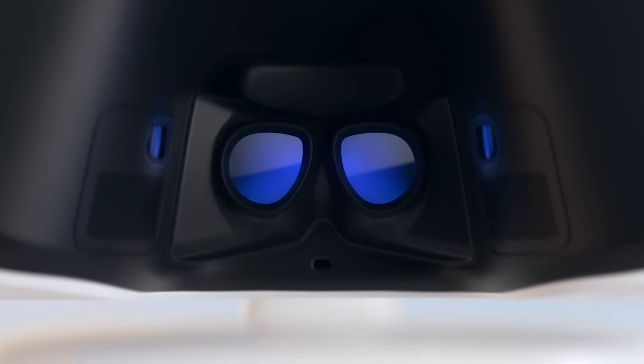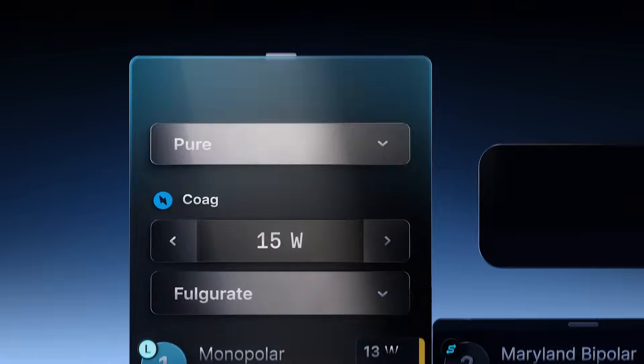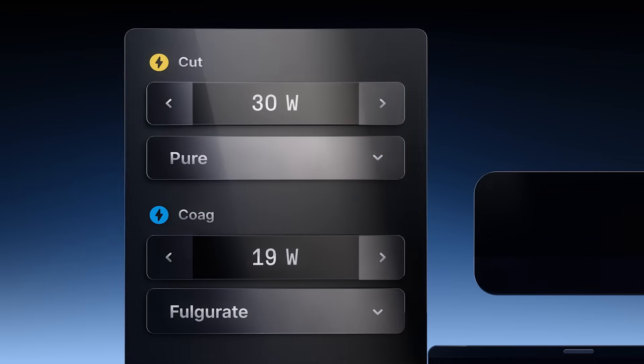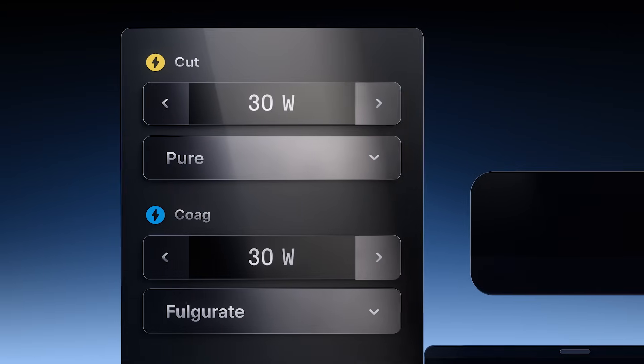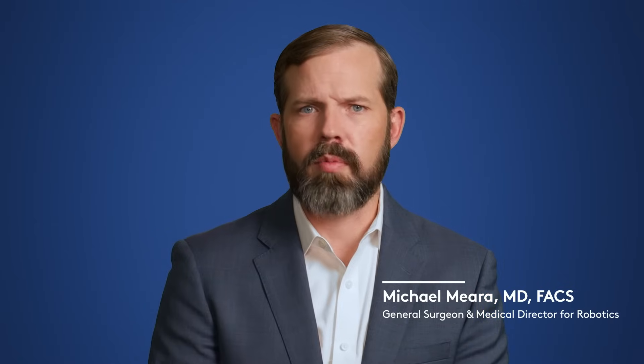We're going to be able to control so many more things from the surgeon console now which I think is really important. It's really an immersive experience that gives you a next level of control that you didn't have previously.